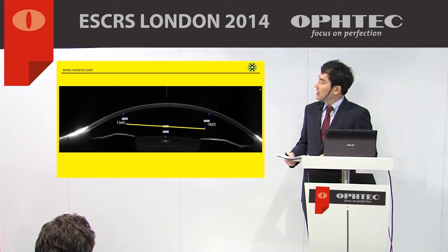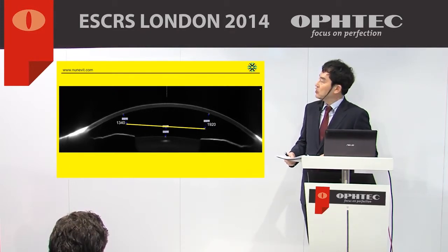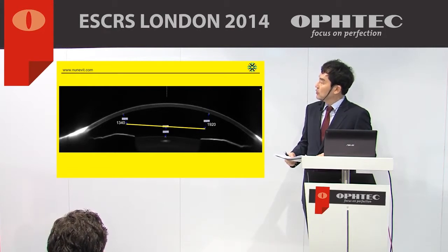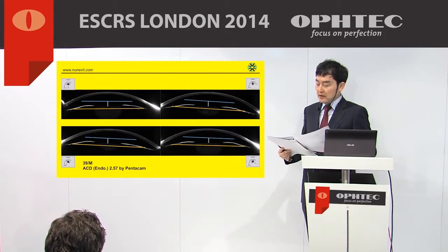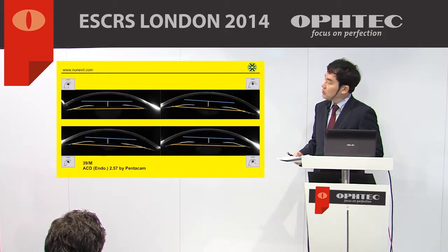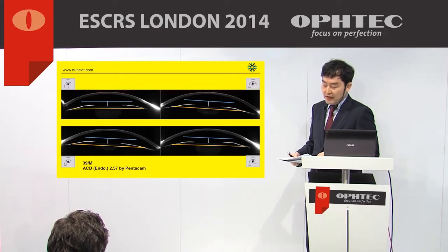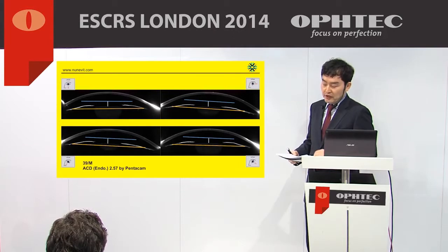Chamber angle and iris status are not that accurate. Examination with the Van Herrick method measures the peripheral anterior chamber depth. In case of a too shallow anterior chamber in the horizontal image or a small eye, I recommend you take 3 more Scheimpflug images at different angles and then choose the final positioning.